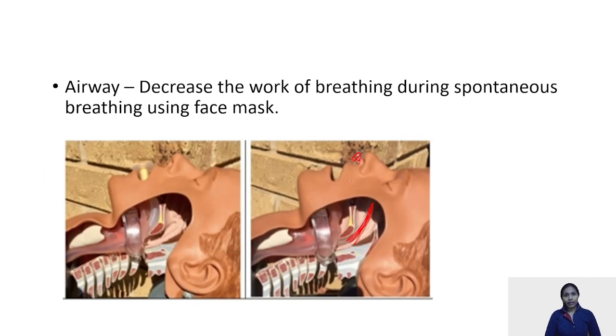When we talk about the airways, they help in decreasing the work of breathing during spontaneous breathing using a face mask. When I talked to you about the face mask, I told you that the face mask leads to an increase in the work of breathing. Whereas when we introduce the airways along with the face mask, they will help in decreasing the work of breathing.